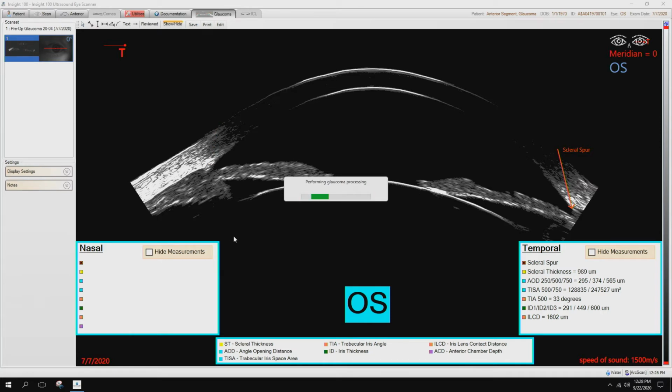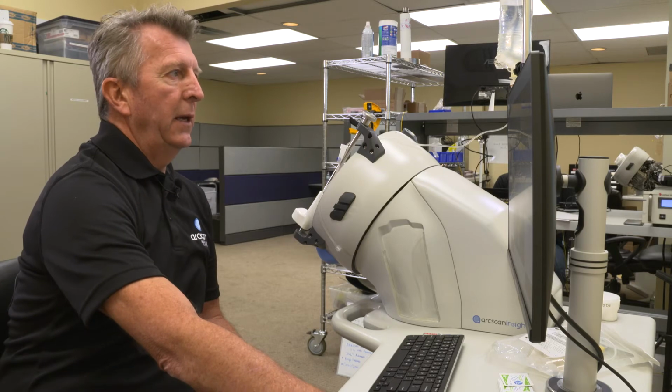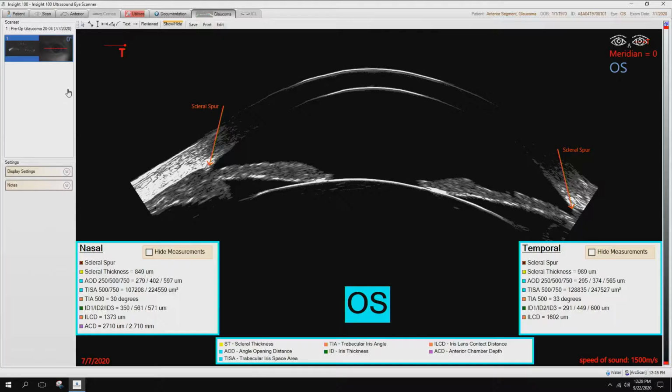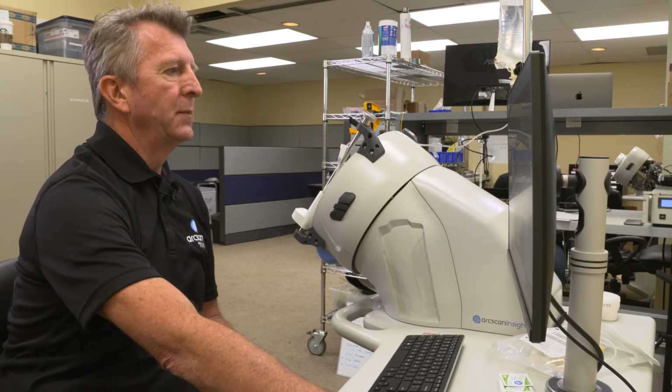The image that you're looking at, again, this is a bi-canthal plane. So up at the top here, I can see there's the meridian going straight across. And in this case, we don't necessarily have to have a patient's eye too wide open. We're not worried about upper lids, lower lids. If you chose to do a meridian from superior to inferior, at the scan setup, we can simply choose that scan to go inferior, superior scan.